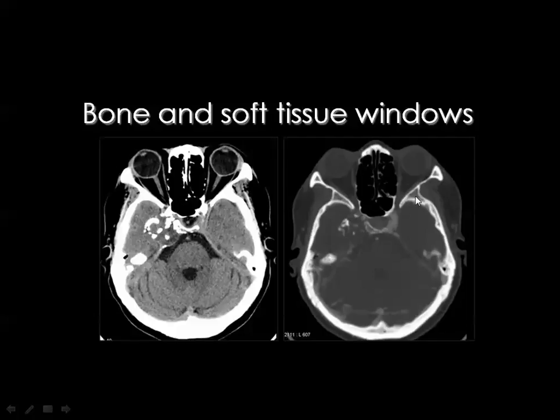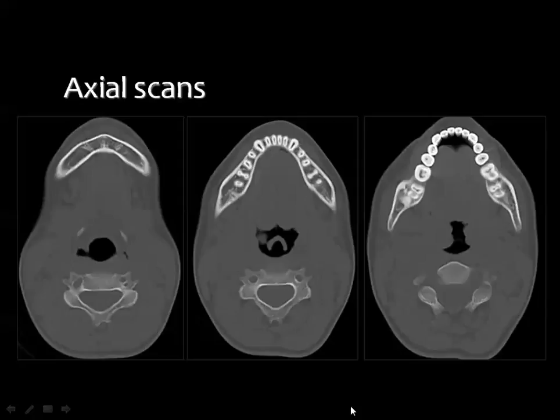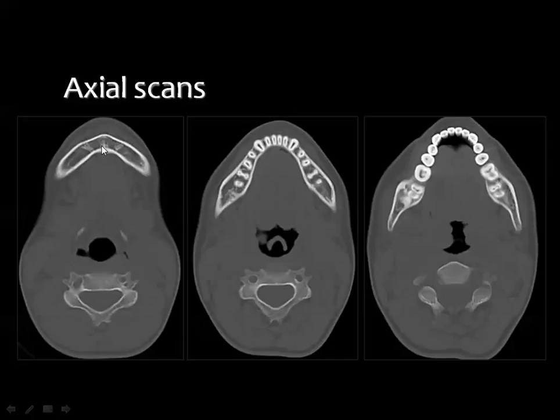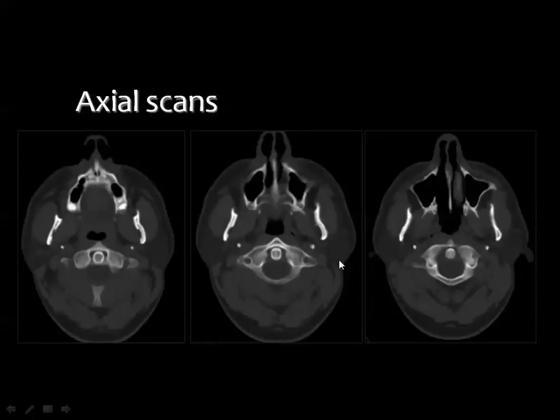Starting with axial images at the inferior border of the mandible proceeding superiorly: this is the symphysis menti or midline part of the mandible. Going upward you can see the teeth, the start of the mandibular ramus, the styloid process, and the maxillary sinus on both sides with the bony nasal septum. More superiorly you can see the maxillary antra, the ramus of the mandible, and the cervical spine.